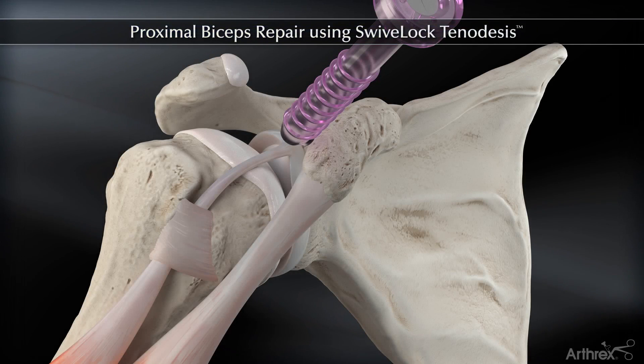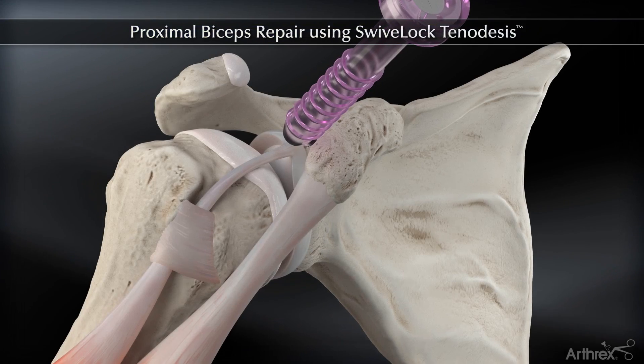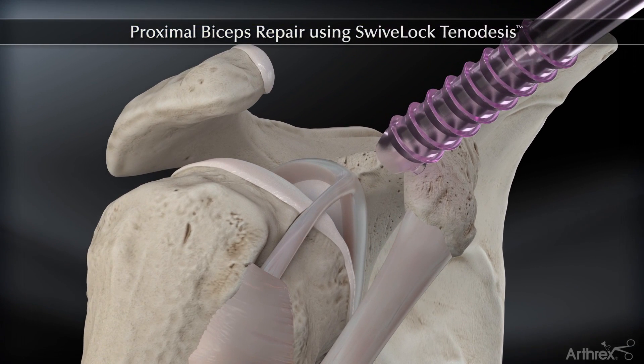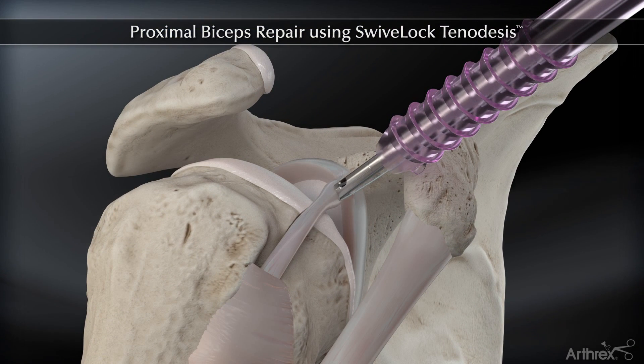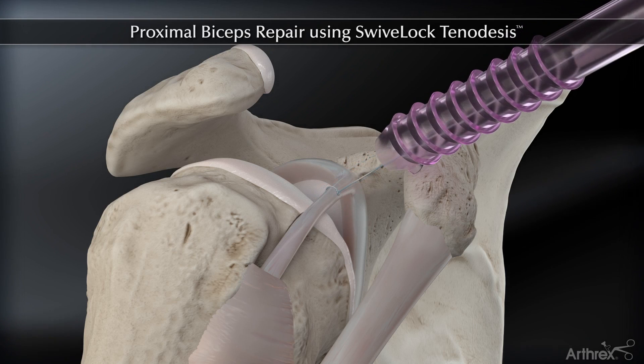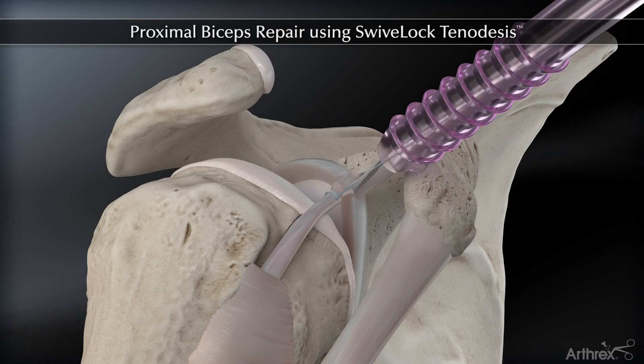The swivel-lock tenodesis system enables all-arthroscopic biceps tenodesis without externalizing or whip stitching the tendon. While viewing intra-articularly, place a tag stitch through the biceps tendon and resect the tendon at its insertion.